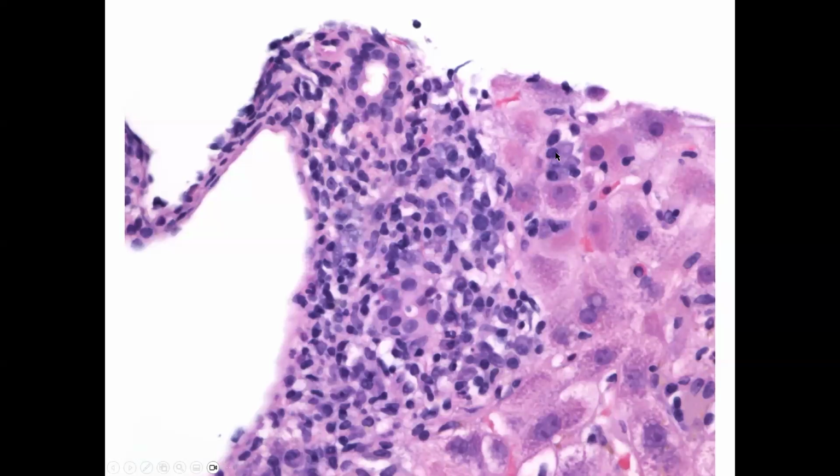And we even see some plasma cells going beyond the portal tract and actually spilling out into the lobule here. And so many plasma cells, and plasma cells within the lobule, make us think about autoimmune hepatitis. And again, here we can recognize this as portal because here now we see a nice portal vein present in association with the bile duct.